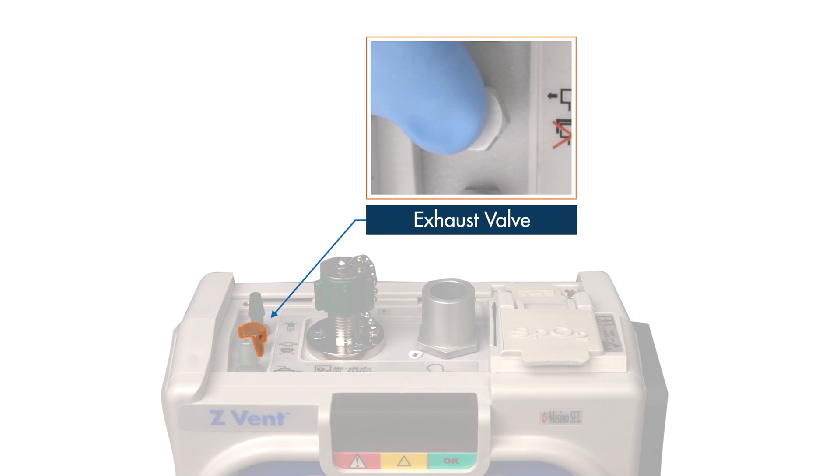Between the two nozzles, the hexagon-shaped part is the backup exhaust valve for the green and silver lines. The exhaust valve prevents excess pressure from building up inside the transducer and exhalation lines.